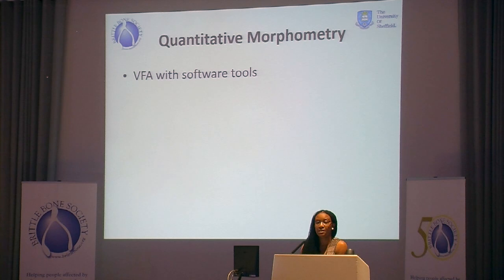So the inter and intra-observer reliability, although I said, and it sounded as if it made DEXA a good thing, was equal to radiographs, they're both actually very poor. So we need something that allows us to more consistently agree with each other whether or not there is a mild fracture. With the severe fractures, there was excellent agreement. Everybody would agree that there was a fracture when there was a height loss of 50 or 60 or 70%. But the milder fractures are the thing that there's a problem with.